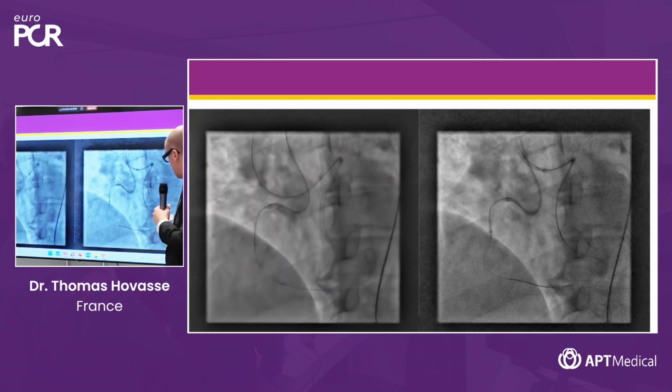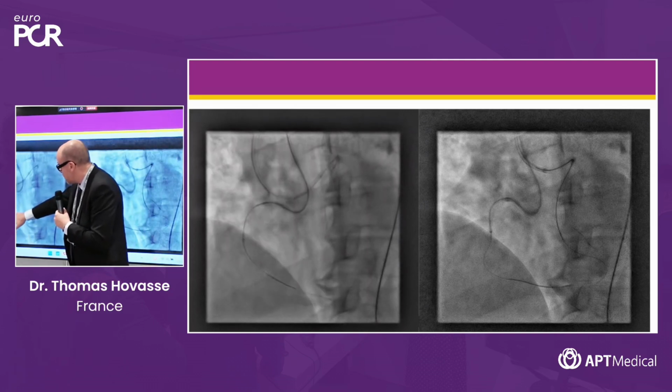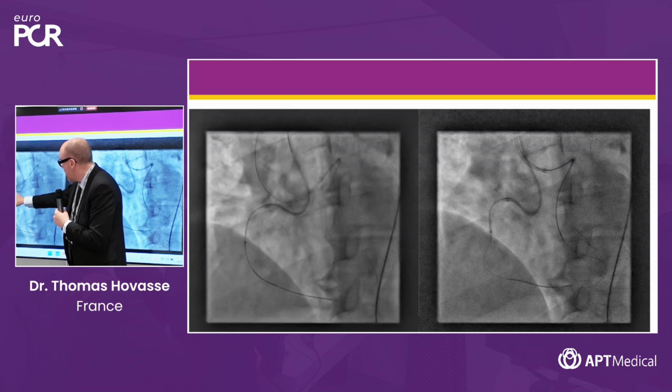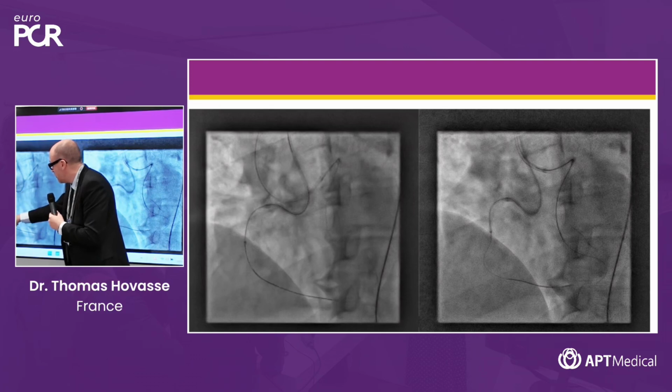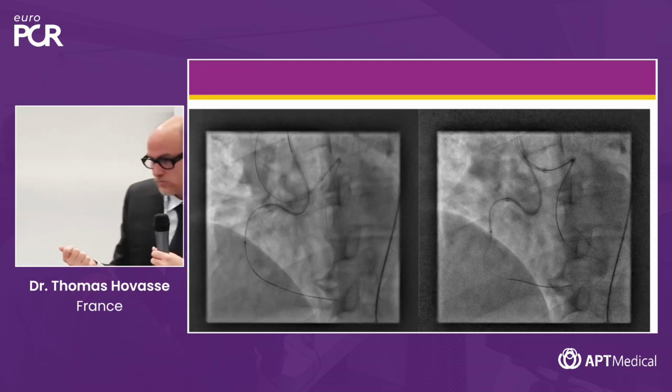You see the problem of this case. There was a lot of tortuosity here. The Expressman was able to go up to there, but we were not sure to be able to go too high. So we have now the retrograde wire here, and we are not sure we will be able to advance the Expressman within the extension, to take an RG3 or a long wire to make the externalization. So what can be the solution here?